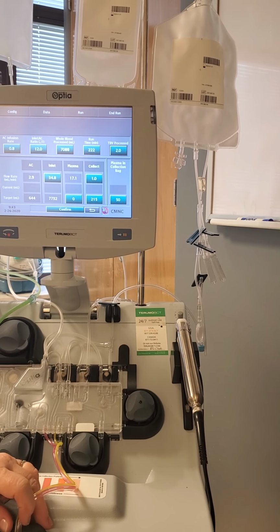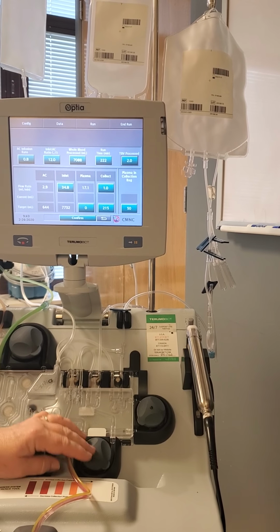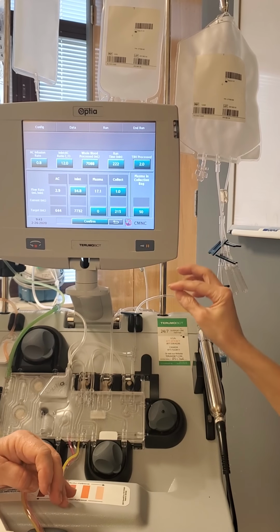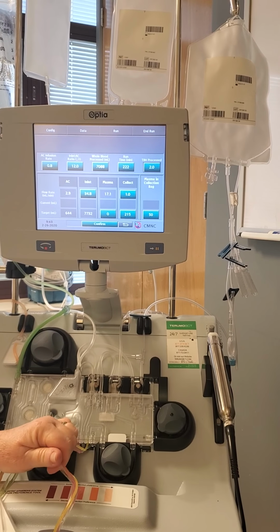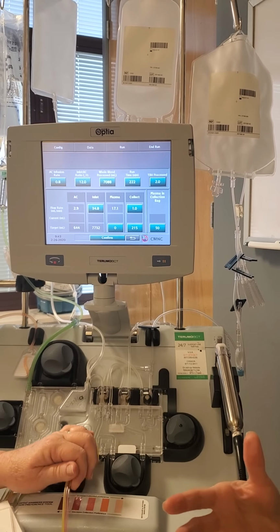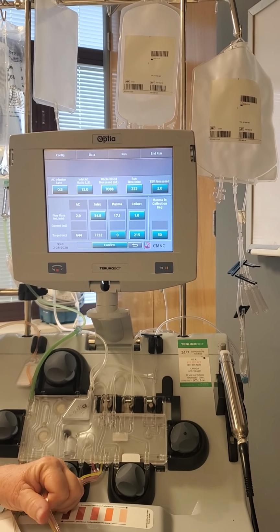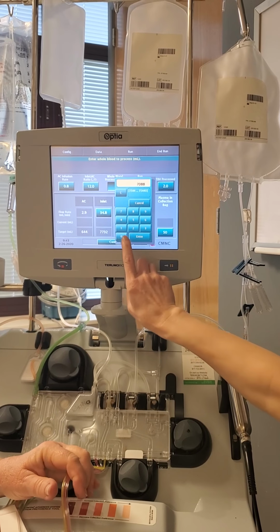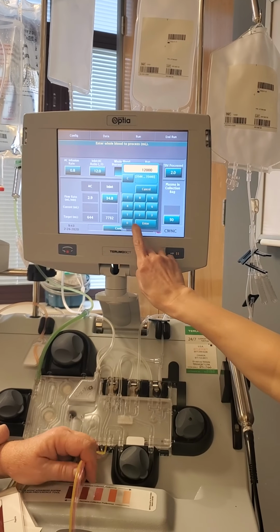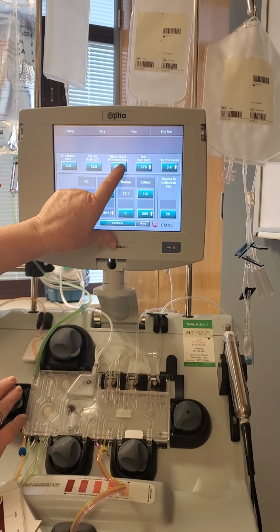So Blanca, on the order, I give the provider a choice, a checkbox, either process 2 times, 12 liters, 6 liters, or others. Some of the team here are so used to checking that 12 liter box. So let's say that we have an order that's a 12 liter process. We just change that number, right? Put it there. Go ahead, do it. This is a perfect time to do it since no patient's on here. So 12 liters is 12,000 mils, right? Because this is expressed in mils. You see the unit of measure.